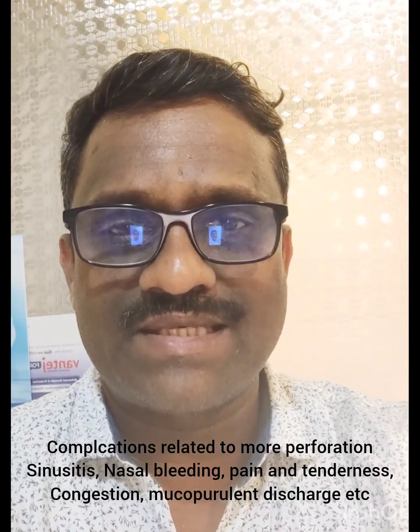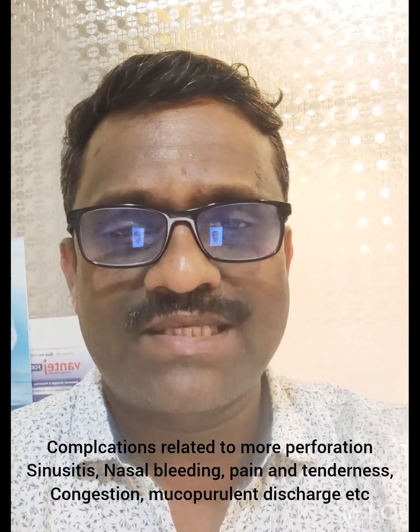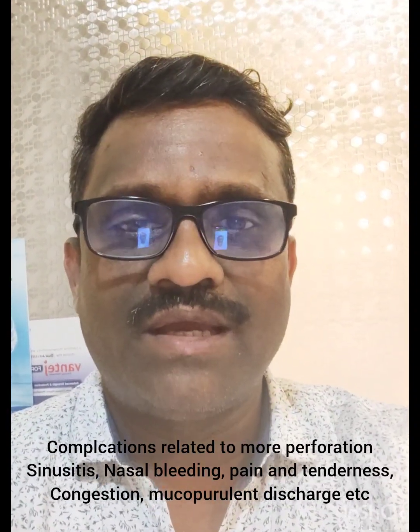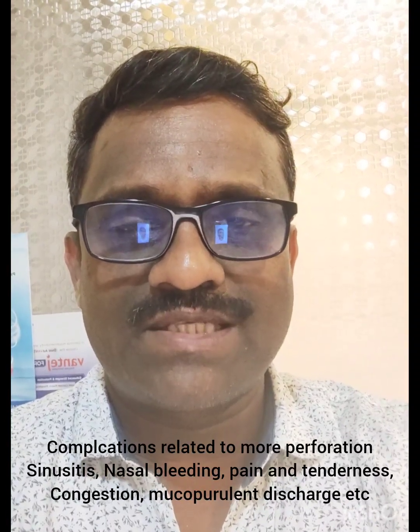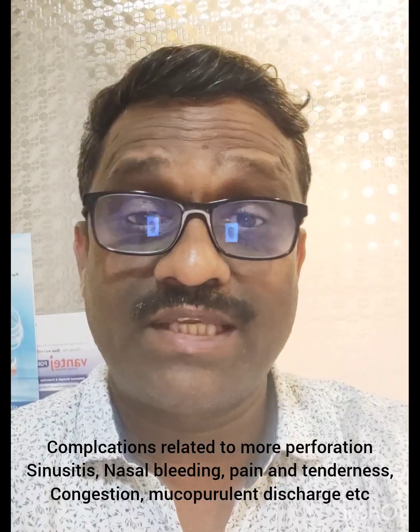I have seen many cases. I have done full mouth cases where I push the implant into the maxillary sinus. Many implants have gone into the maxillary sinus up to 3 to 4 mm. So I have cases of 3 to 4 years or 5 years follow-up.